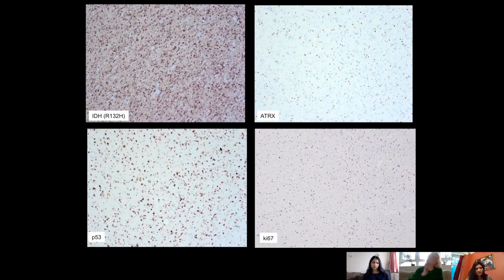The other question that we have to solve here is because this tumor was classified in 2007, and because morphologically we see both oligodendroglial-like and astroglial-like cells, this could be either a high-grade oligodendroglioma or a high-grade astrocytoma.